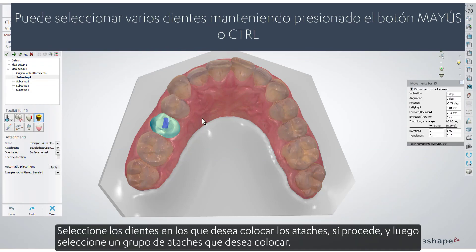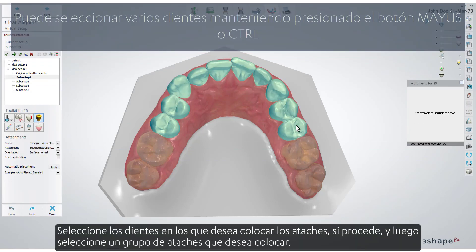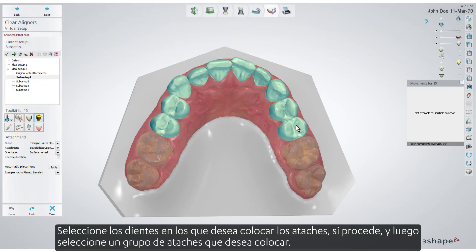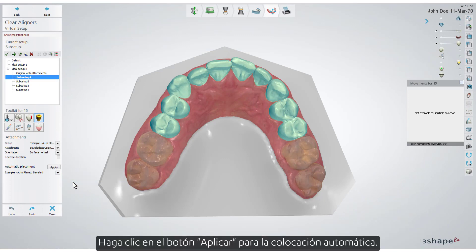Select the teeth you want to have attachments placed on, if relevant, and then select a group of attachments that you want to place from. Click the Apply button for automatic placement.